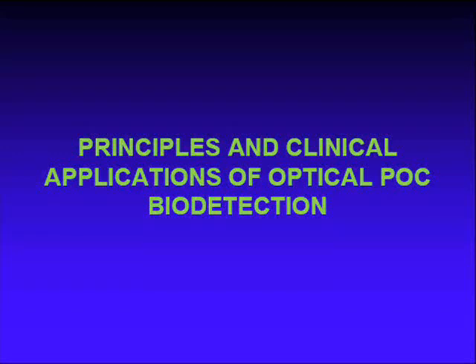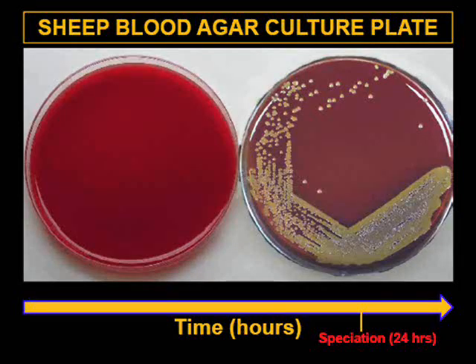We now move on to our next section, principles and clinical applications of optical point-of-care biodetection. We'll start off with the specific example of pathogen testing. This slide shows a sheep agar culture plate. This is a traditional method of pathogen detection.